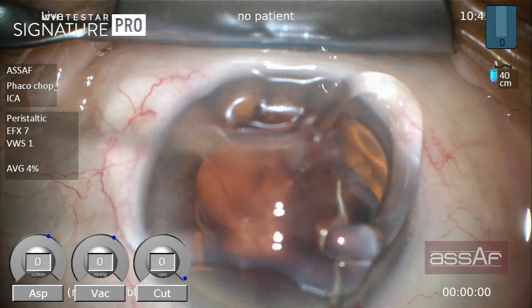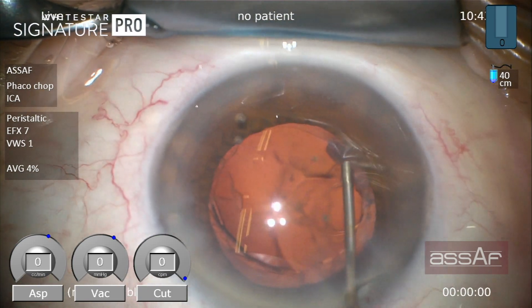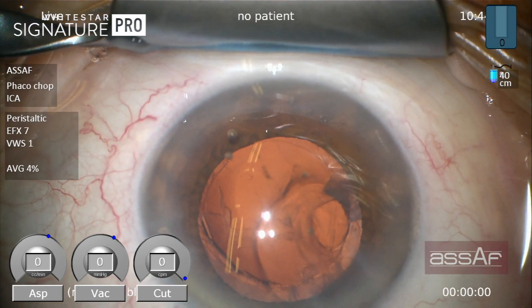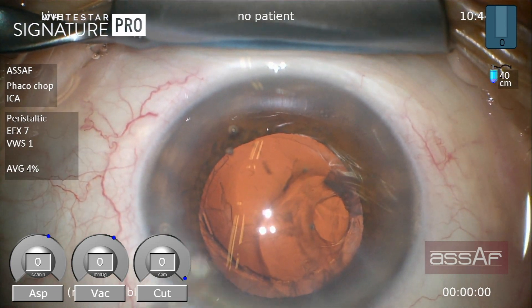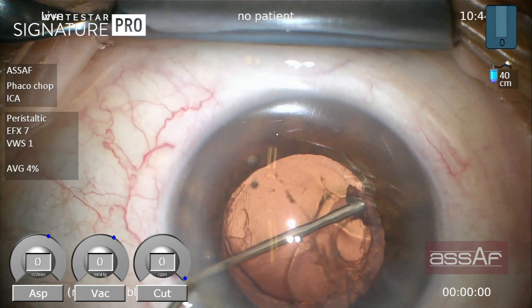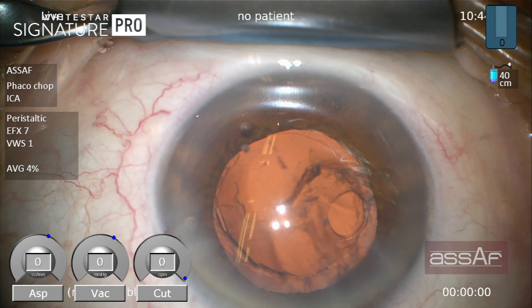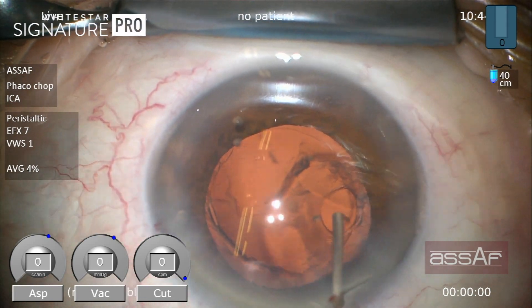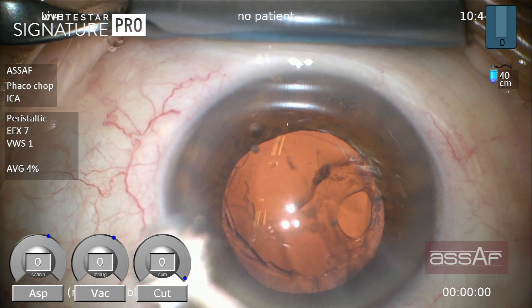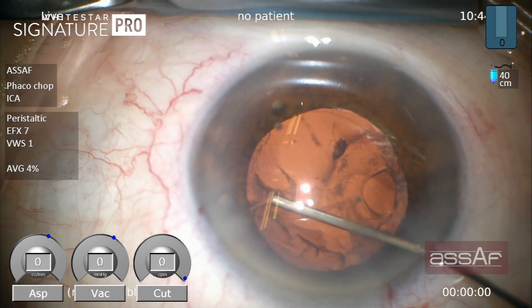Otherwise the vitreous might be aspirated with the cortical fibers during manual aspiration. I learned this technique from Bob Osher through one of his videos and found it very useful in this situation where we have a lot of remaining cortical fibers inside the capsular fornices and a break or opening of the posterior capsule. Sometimes the aspiration needs a lot of patience, and every now and then we need to inflate the anterior chamber and tamponade the vitreous with dispersive OVD.